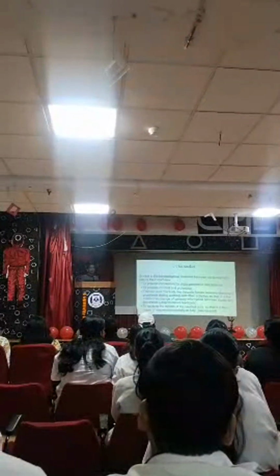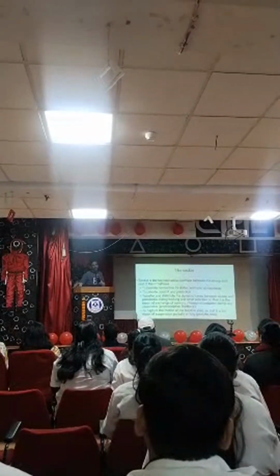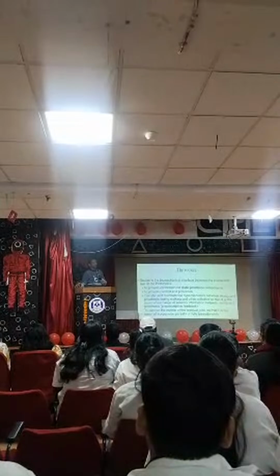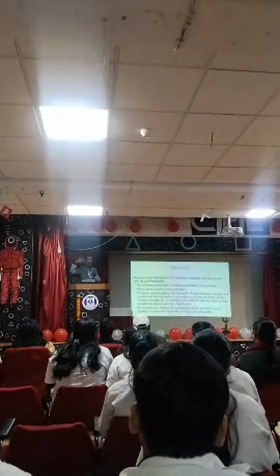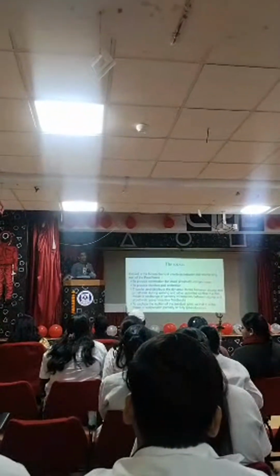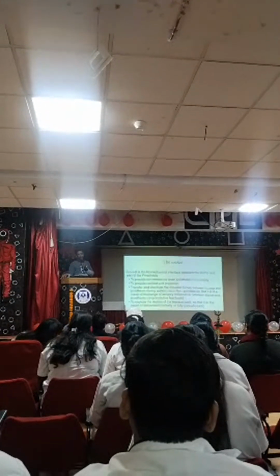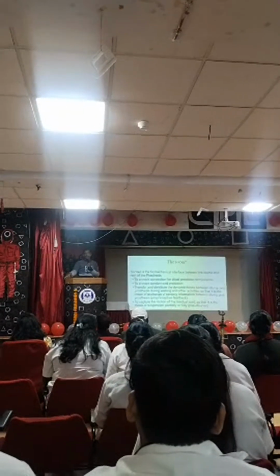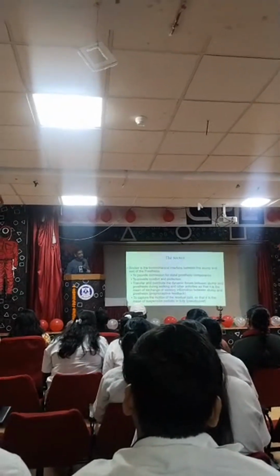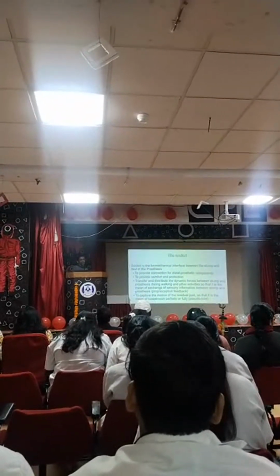Our patients in the OPD or in the indoor IPD are lying down and doing different activities before getting a prosthesis, right? Like patients getting exercises before getting a prosthesis. But they are without any support or any protection of the stump which is amputated. So there the socket is very important. A socket can protect the stump from getting injured during the physical exercises. So we can understand that the socket is not just for the prosthesis, it is also for basic work like different exercises during the IPD activity or the patient doing at home just after the amputation.